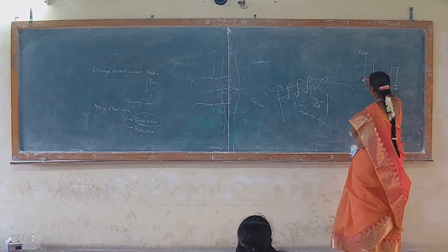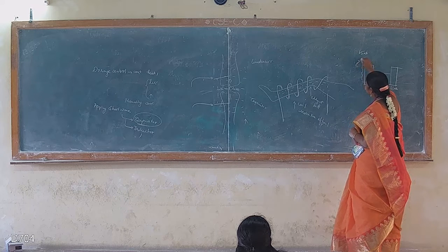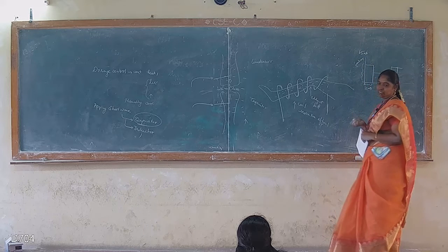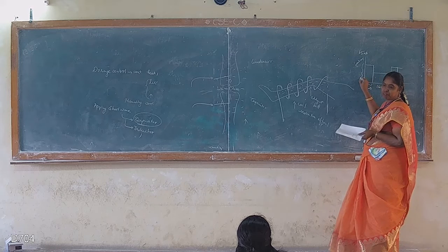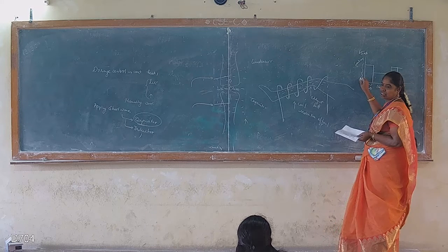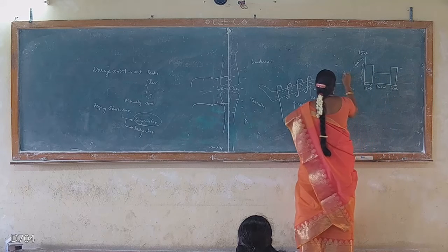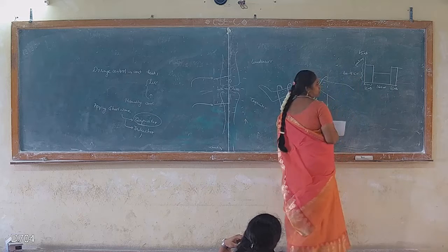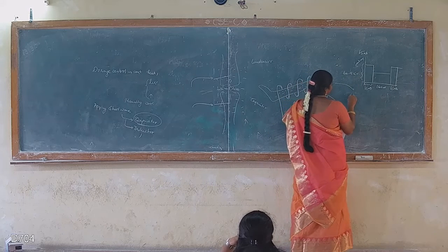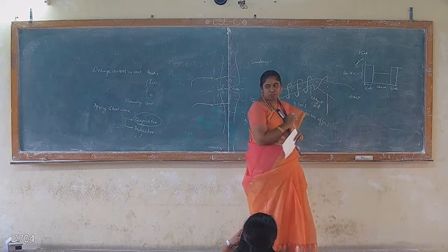And moreover, there is the peak voltage. This peak voltage determines the amount of power to be delivered to the particular subject. Here the maximum is 600 to 975 volts, so that we can have a maximum of 400 watts.